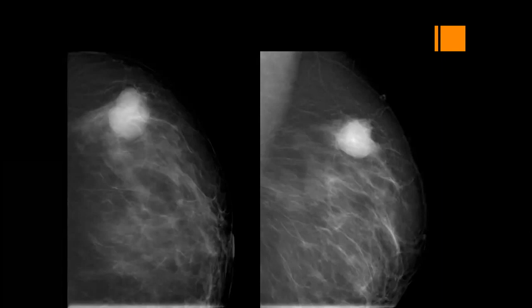For BIRADS 3 you have to have non-calcified, circumscribed, sorry, circumscribed. So, is it circumscribed? On craniocaudal, it's circumscribed, and on mediolateral it may be partially obscured. Still, partially obscured is probably a benign finding.